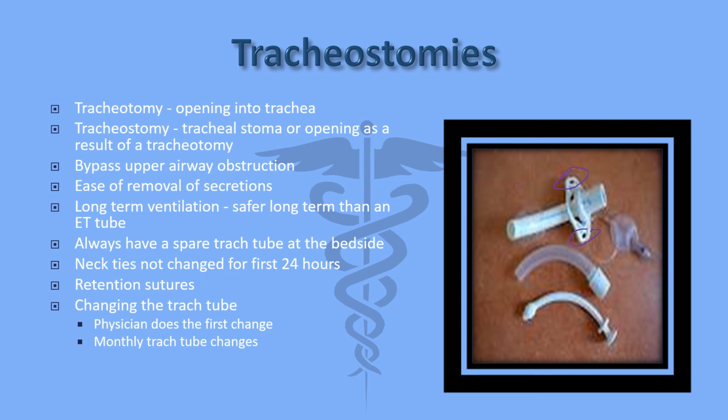Usually the physician does the first change, and again, it's at the bedside. After that, respiratory therapy does that. We talk about all of the tubes, the obturator, and the inner cannula in the care of the trach.